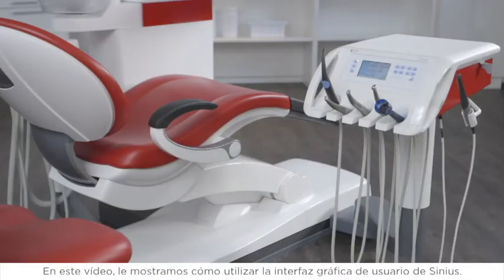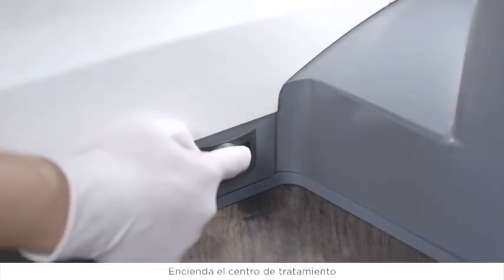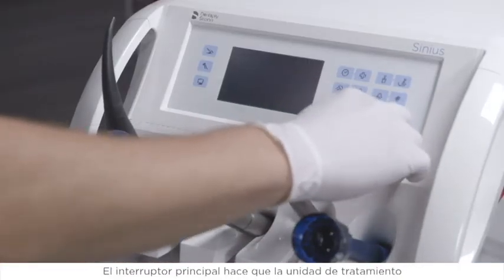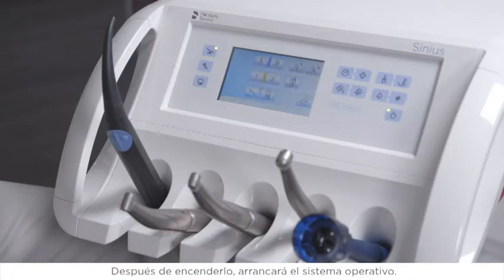In this video, we show you how to use the graphical user interface of Sinius. Switch the treatment center on using the power switch at the foot of the treatment center. The main switch switches the treatment center from the standby mode to operational readiness. After it is switched on, the operating system boots up.